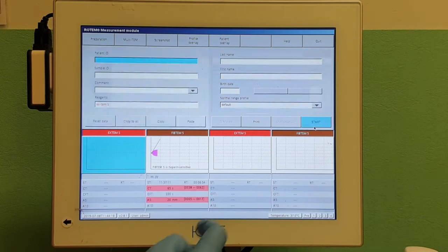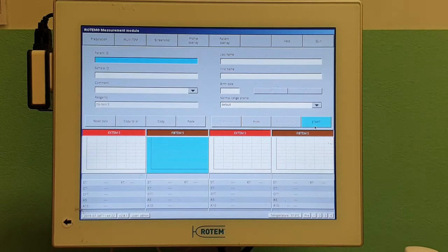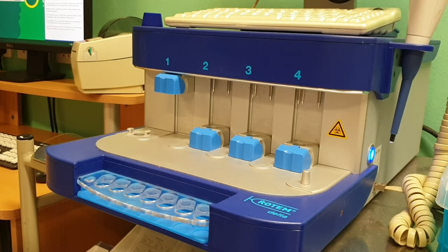Once finished with the run, you can press 'Clear Run' and that will get rid of your results on both channels. Then press 'Quit' and that will get you back to the main screen.